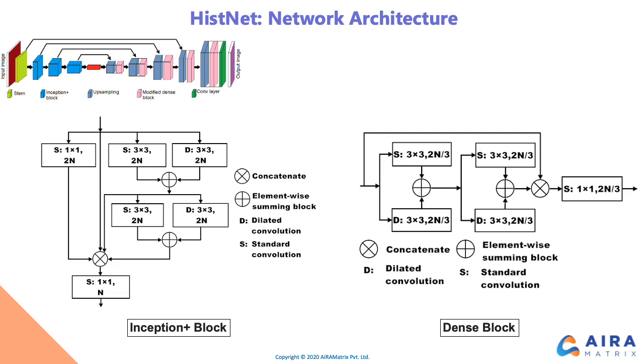To improve the model's ability to finely delineate morphological features on whole slide images or whole mount images, we improve the decoder to have higher context information. For this, we use a dense shortcut connection at each decoder stage, which concatenates information from the previous stage with lower resolutions with the output of the current stage convolutions.